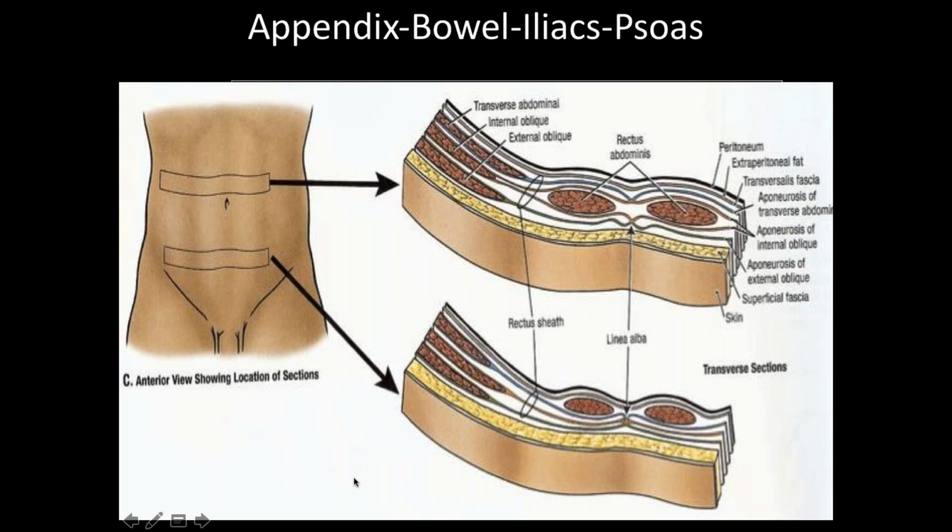It's going to be skin, so the ultrasound is going to be right here, and it's going to be shooting down an ultrasound beam right through the abdominal wall into intraperitoneal content right here. So as the ultrasound beam is cutting through, it's going to go through skin, subcutaneous tissue, and then a layer of muscle. There are actually 3 layers here. It's going to be the external and internal obliques, the transverse abdominis, and then finally the peritoneal lining here. And then deep to that peritoneal lining, you'll end up seeing bowel.